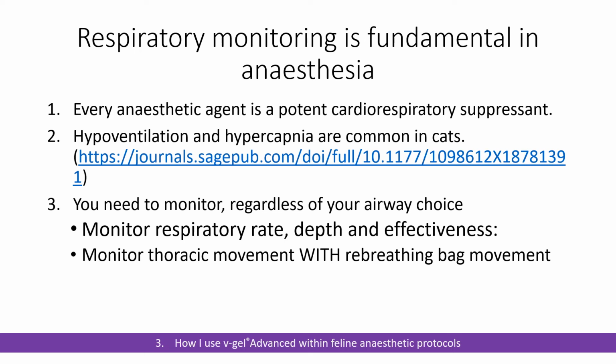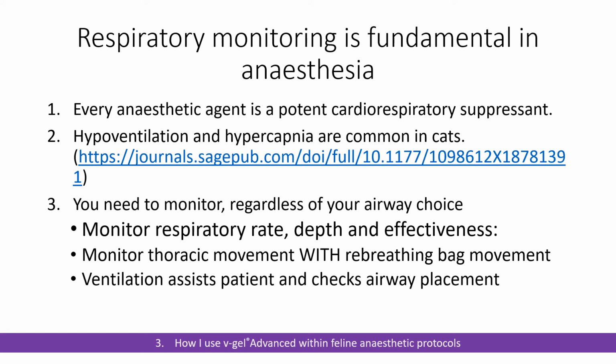It's telling you respiratory rate, as we're always doing, but it's telling you about how effectively that patient is shifting gas. It's telling you how effectively your airway management tool is working. Is there a kink in your tube? Is there mucus blocking? Is your anaesthetic circuit working? Do you have oxygen flowing? A whole bunch of different things. Think about ventilating your patient perhaps more frequently than we might have done in the past.